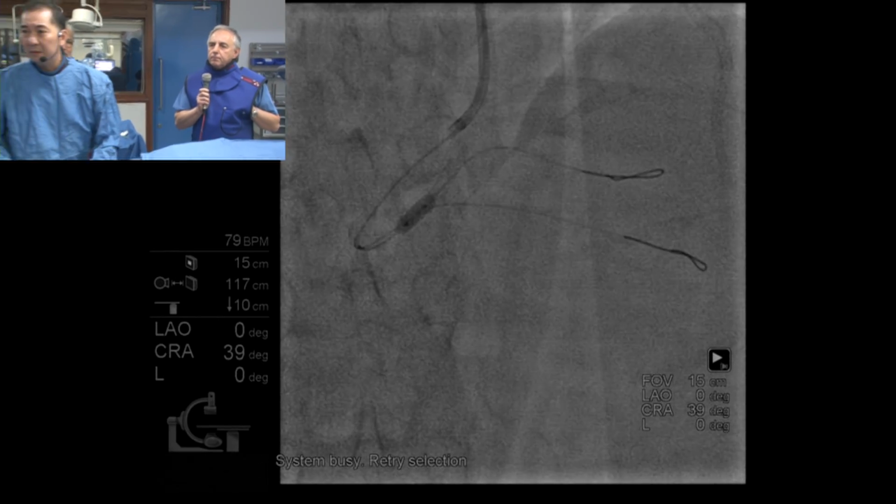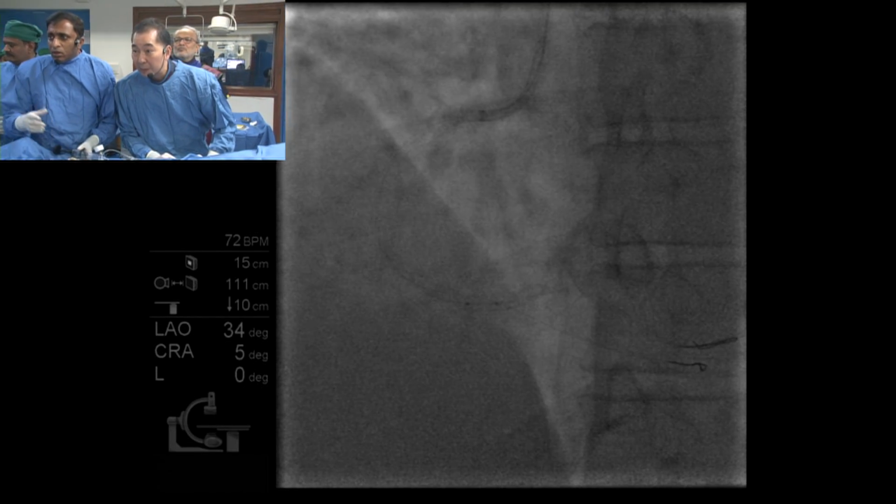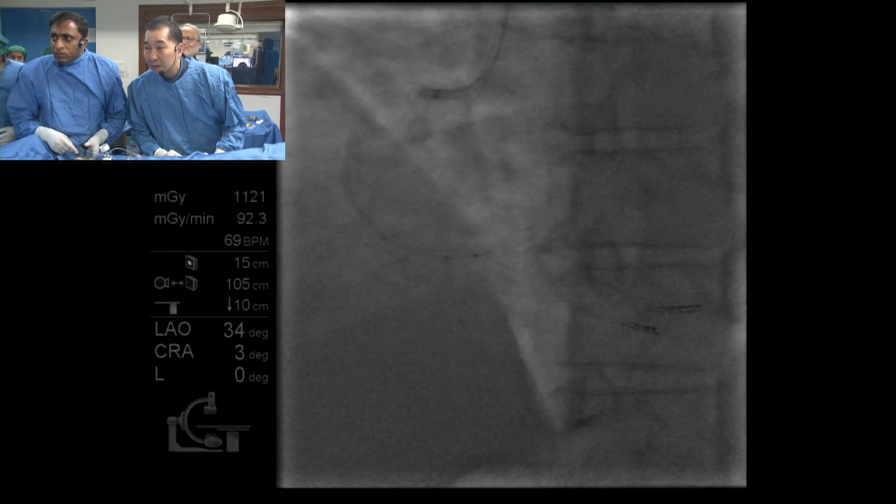Yeah, aerial. I want to see a proximal. Yeah, proximal. So, have you come across that situation where you inflated the balloon in the side branch, the jailing technique, and then there was difficulty taking it out? No, I haven't had trouble removing the balloon.